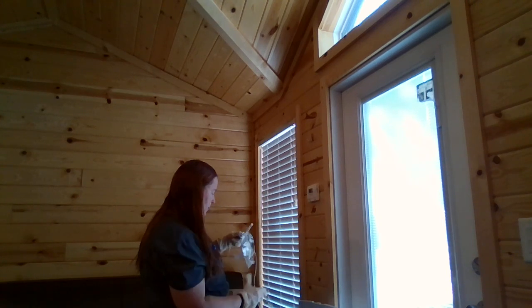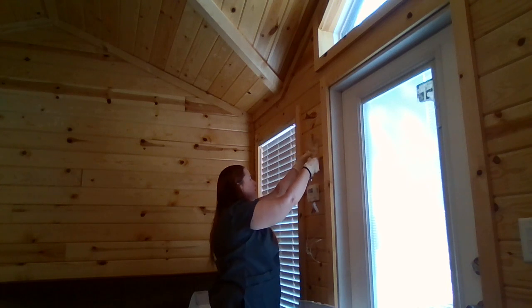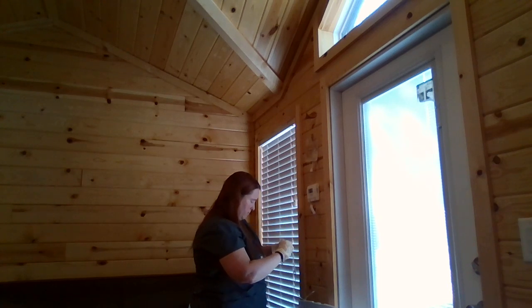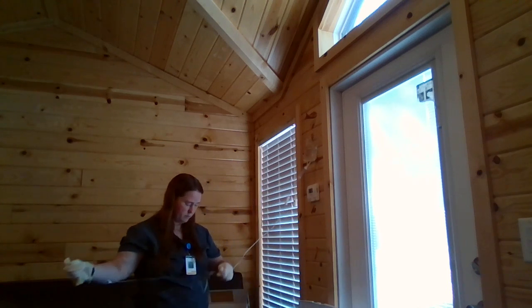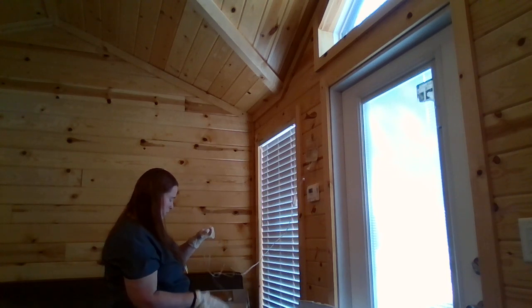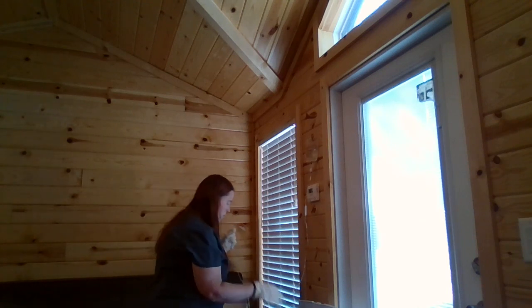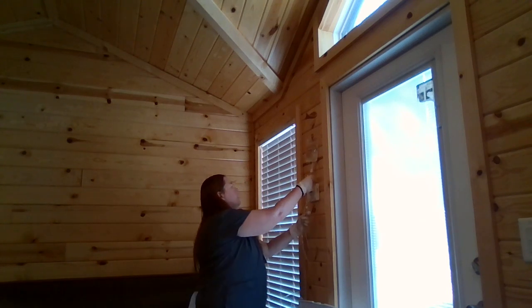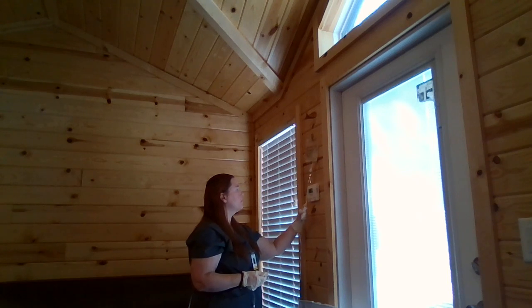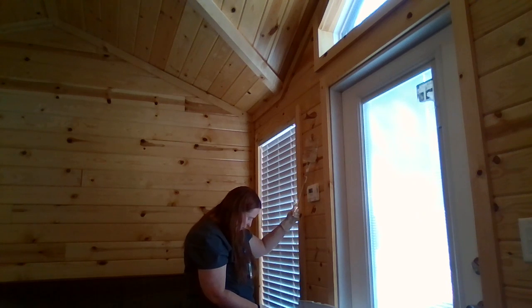This is so that I can prime the tubing. I'll hang my bag and make sure I get all the air out of the line.